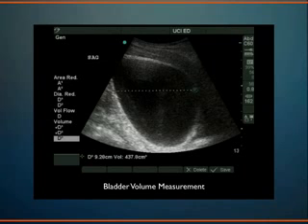Well, their post-void residual, 400 cc's, that's a lot of good information to pass along to a specialist like a urologist. And we can also measure their prostate on bladder ultrasound. On transabdominal bladder ultrasound, we can measure the dimensions of the prostate. So measuring the prostate and having that post-void residual is useful in many different locations, whether you're in the outpatient clinic, the ER, or the ICU. Those are all good information to have about your patient. Does that answer your question?